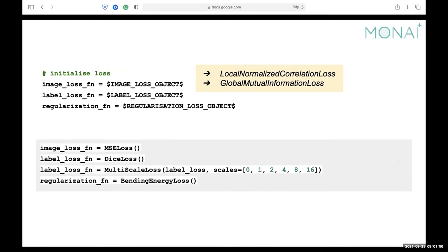We also initialize the different losses. MONAI has two specific image losses for registration: the Local Normalized Correlation loss and the Global Mutual Information loss. More details can be viewed in the MONAI API. In this tutorial, we use the mean MSE loss for image loss, the Dice loss as the label loss wrapped in a multi-scale loss wrapper for label loss at different scales, and the bending energy loss for regularization.